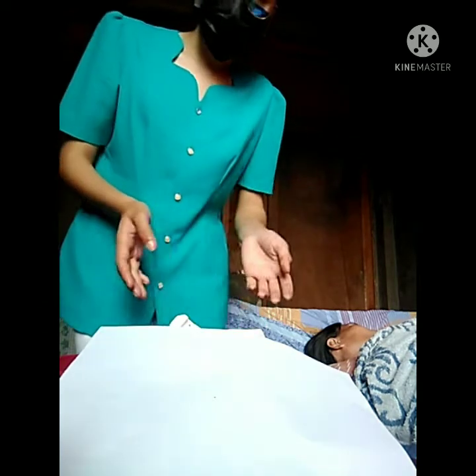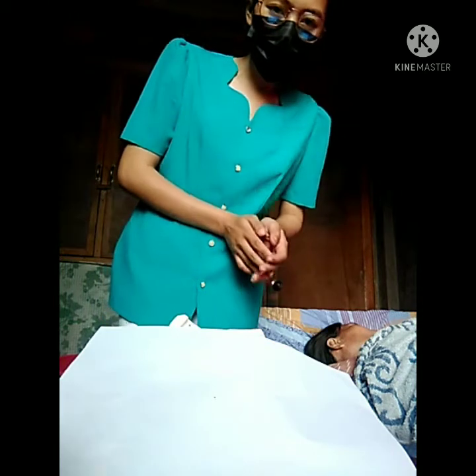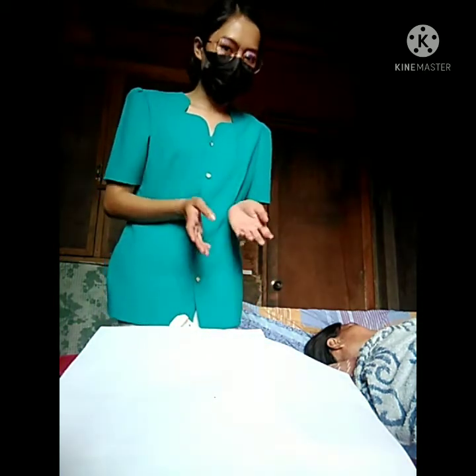And now let's proceed to the dressing. Please allow me to introduce the materials that I will be using right now.